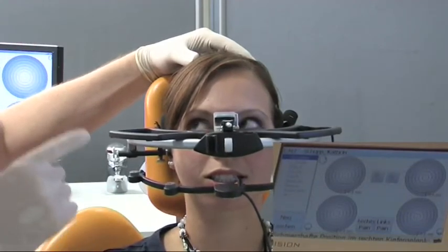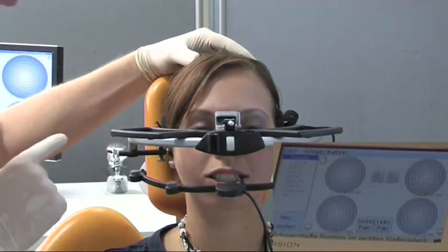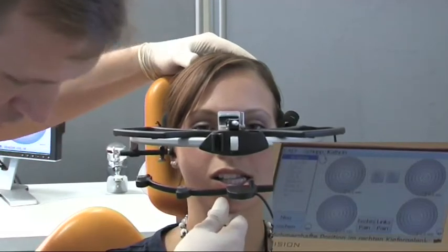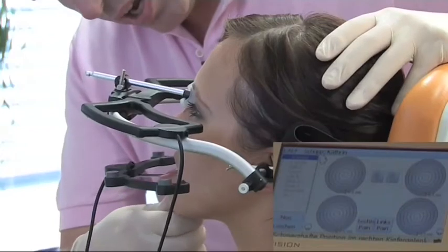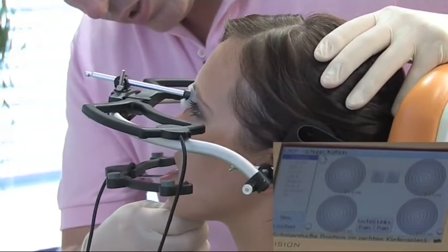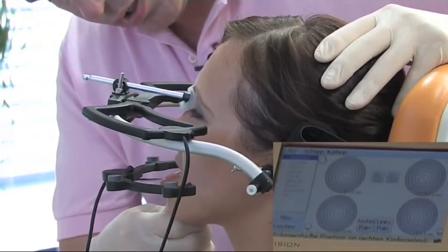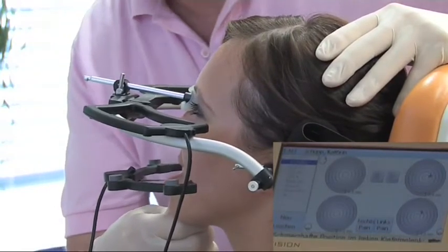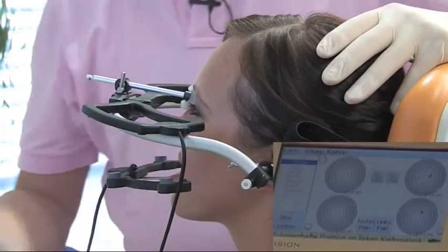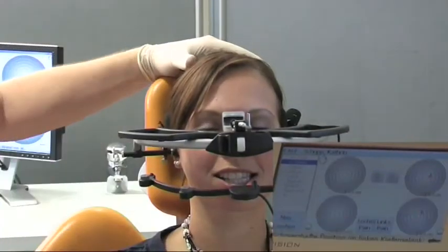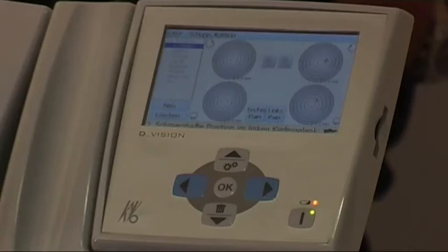First of all, we will repeat one of the tests from the clinical examination where your complaint first appeared. Move your lower jaw again a little to the left. Good. Stop. I will now continue the movement by pressing to the rear. As soon as you feel any pain, simply raise your left hand. That was the site of the pain, on the left side. You can see that we have marked it here — where the red crosses are. That is your condyle when you have your pain. We now know where the condyle is when the pain appears.